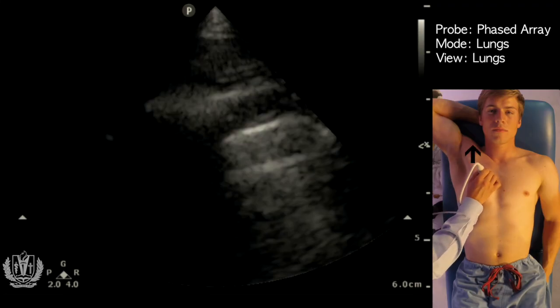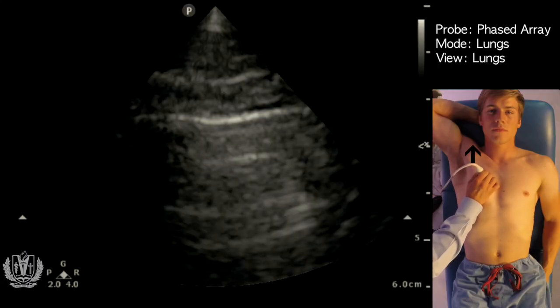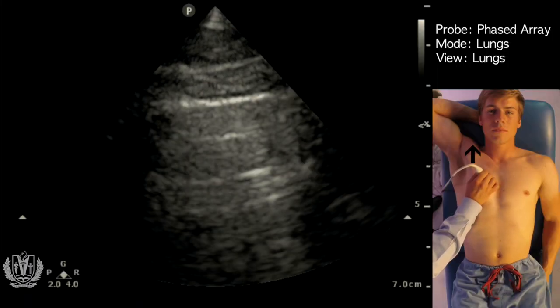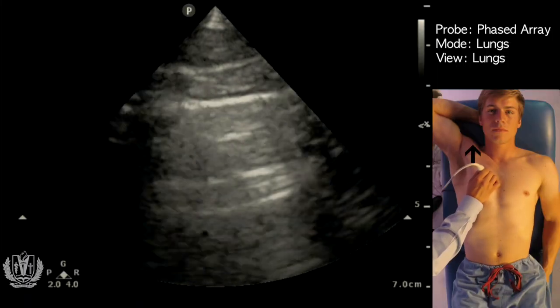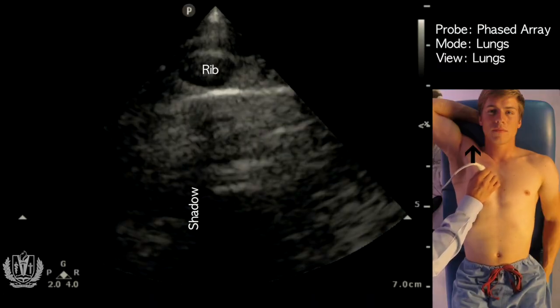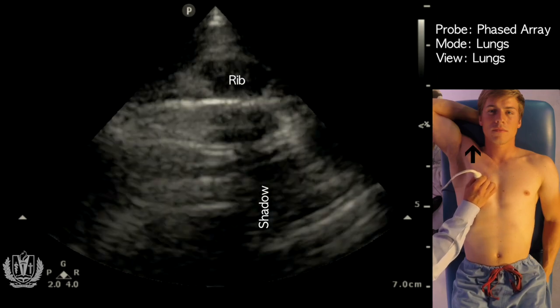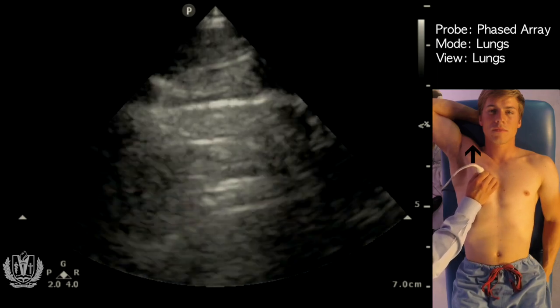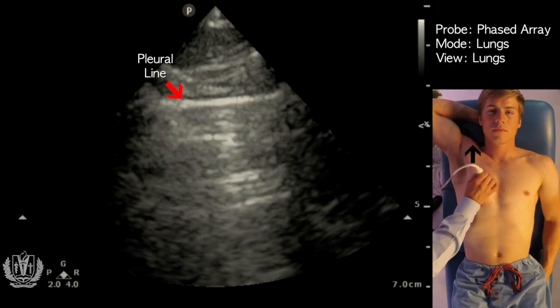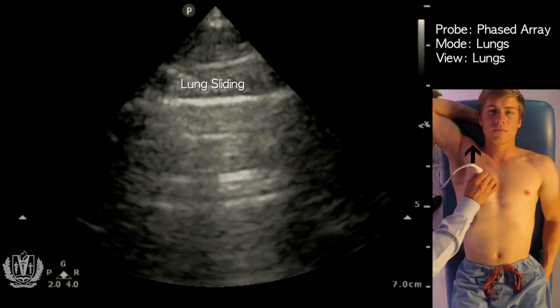Starting in this quadrant here on the right side, what you're looking for is the rib shadows. Here you can see a rib shadowing down, and here's another rib and its shadow. In between the ribs you see the pleura sliding back and forth, and you can see lung sliding as he breathes in and out.